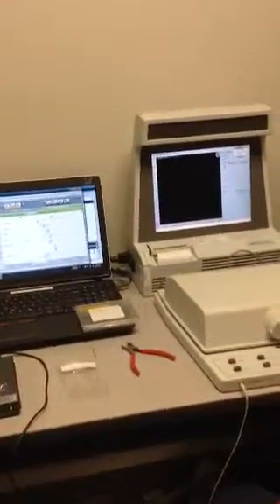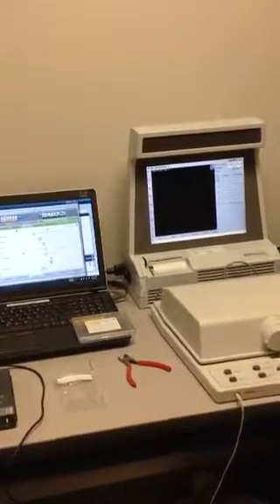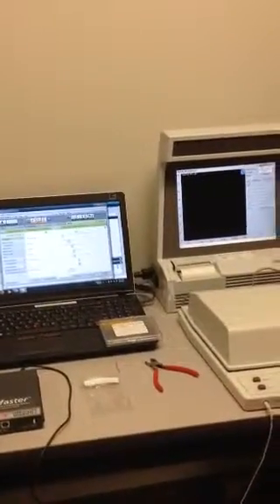So we're going to estimate where this is possibly 3 feet behind her head, and it also has to be adjusted to be at head level. So you want them to be in line. So you plug it into the back of the VeriFit.